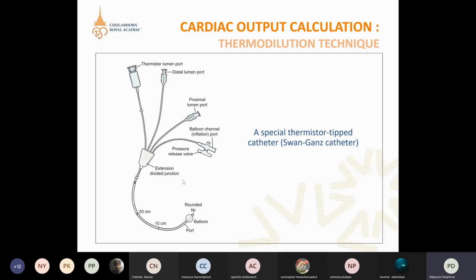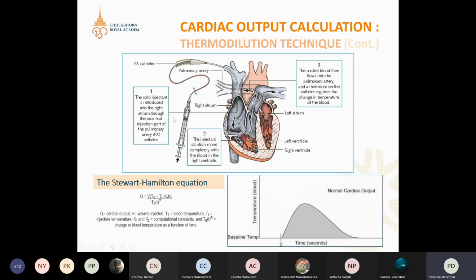Definitely, the doctor will use the Swan-Ganz catheter again, advancing the catheter inside the right side of the heart and placing the tip of the catheter inside a branch of the pulmonary artery like this, without blowing up the balloon at the end of the catheter.